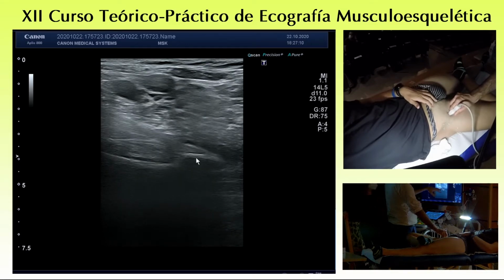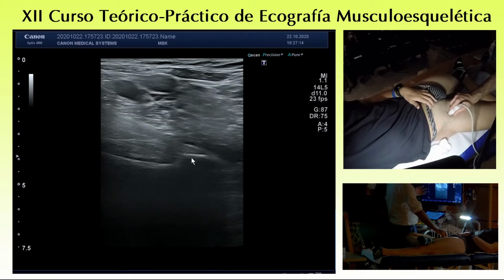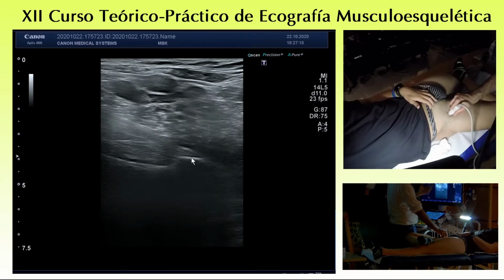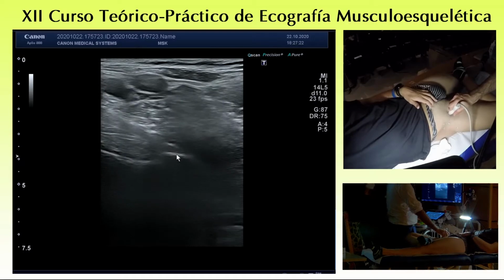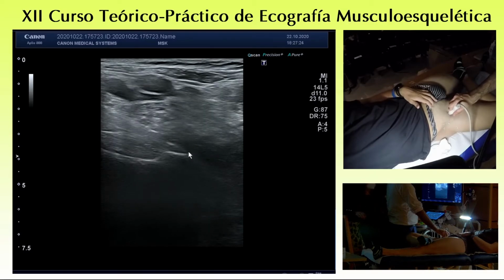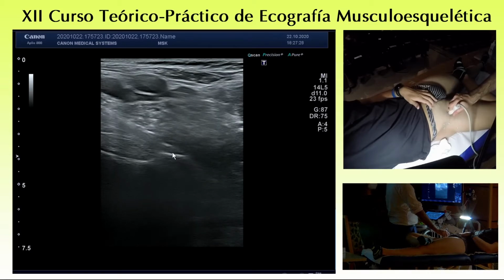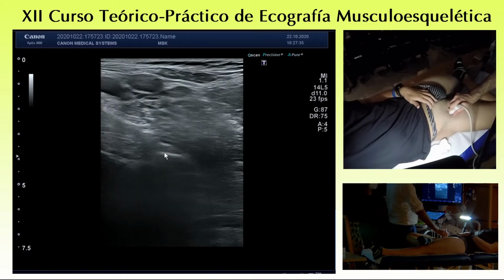Even commonly, you may see a kind of osteochondrosis in a young patient, maybe a young soccer player who had increased traction over the tuberosity, and even when they are adults it results in some fragmentation, something like Osgood-Schlatter, that may also occur.